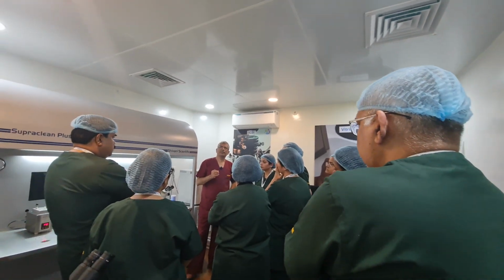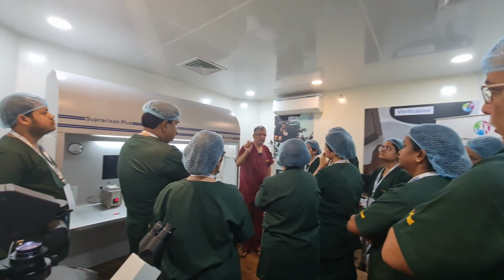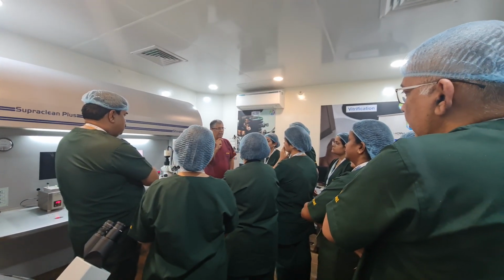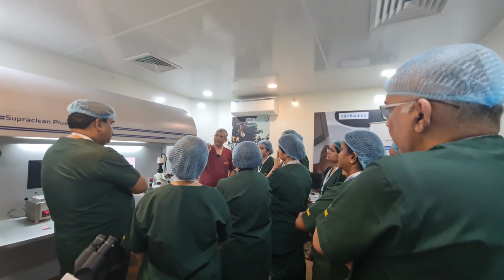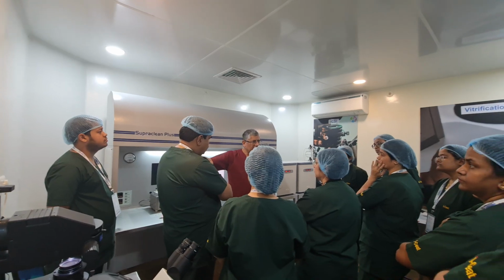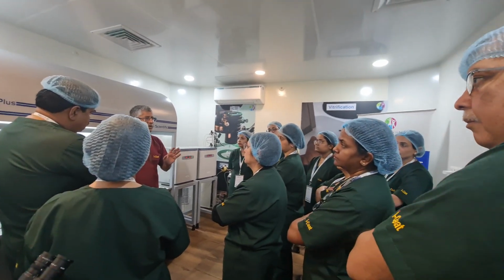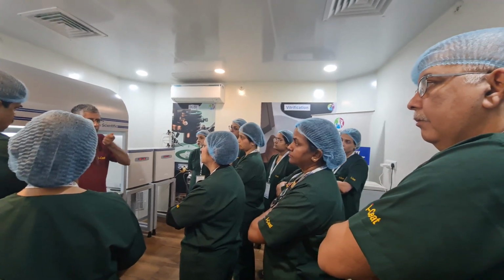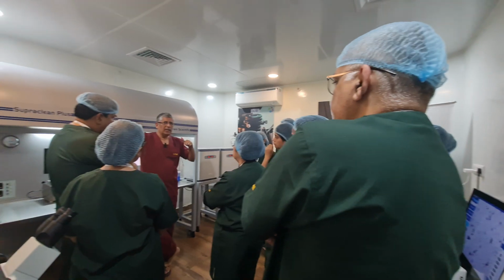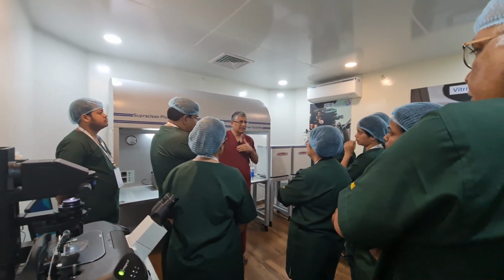What you have to know here is, it may be a paint, it may be modular, it may be tiling, it may be biocladding. You can never make a hole in the lab again. In the lab, in case you make a lab once, it is made forever. You will never call the electrician to make a hole in the wall and put one more point. So when you want to make a lab, two things come to your mind. Where do I see myself after 5 years?